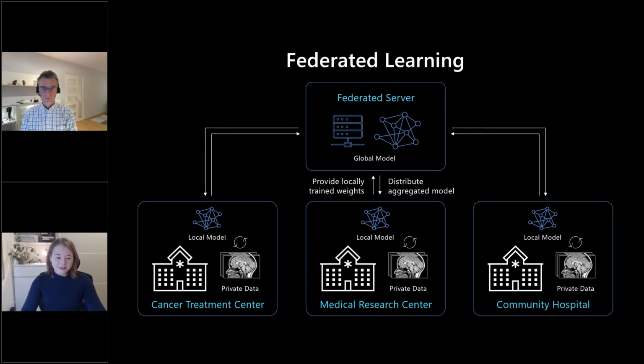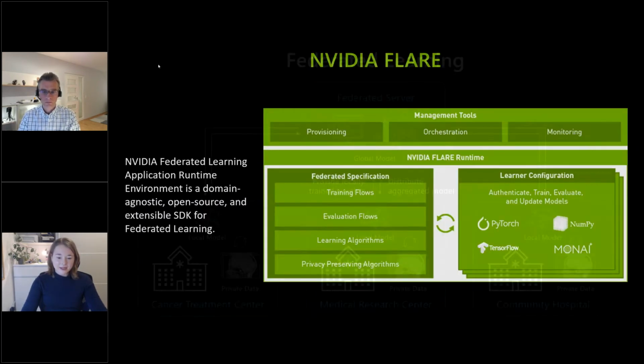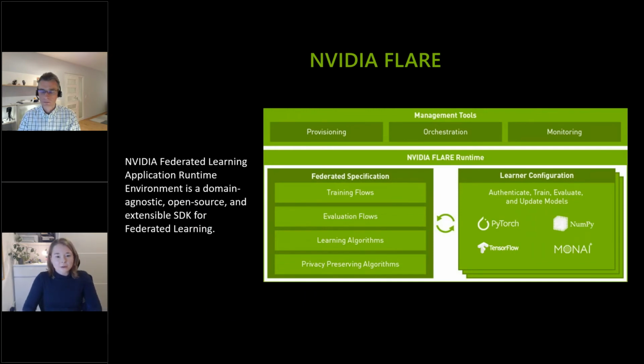So that's about federated learning and why it's interesting in a medical context. The demo that we are working on specifically leverages a library from NVIDIA Flare. NVIDIA Flare stands for Federated Learning Application Runtime Environment, and it's an open source and domain agnostic SDK for federated learning. So this can be used in combination with a lot of different frameworks, but in our case, we will use PyTorch to train a model in a federated way on a medical use case.